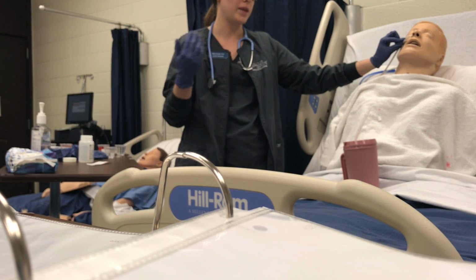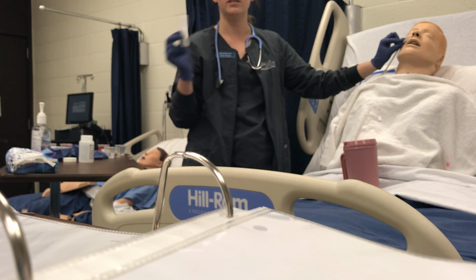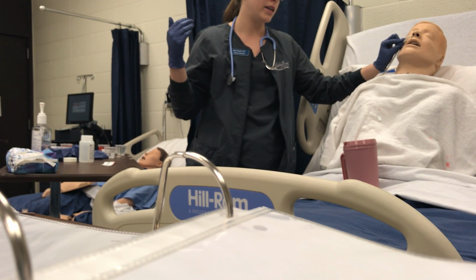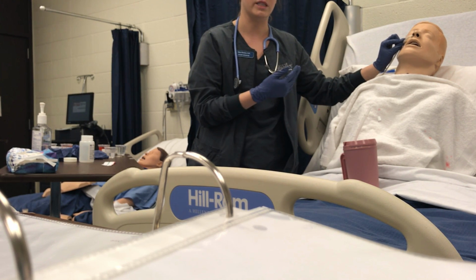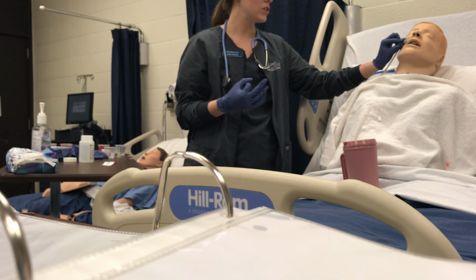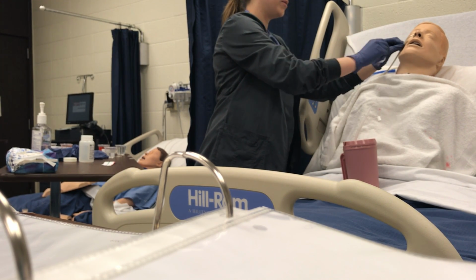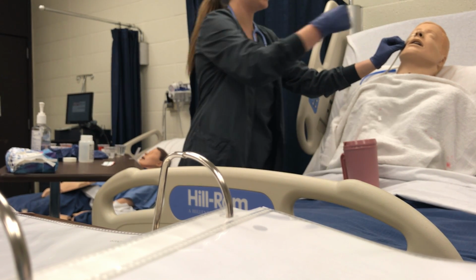We're going to aspirate some gastric contents and check it with a pH strip to make sure that that lines up with stomach acids. I would also take a piston syringe, about 10 to 30 mL of air, and infuse it into the tube and listen over the epigastrium for a whooshing sound. That would ensure placement was there. The 3rd way, which is the most definitive way, is actually taking an x-ray. And so once the x-ray was here, they said that it's in place and we're good to go. I would go ahead and remove this, and I would secure it to the bridge of his nose.